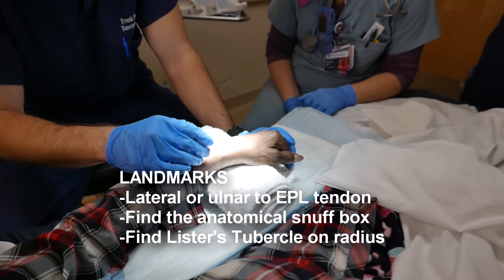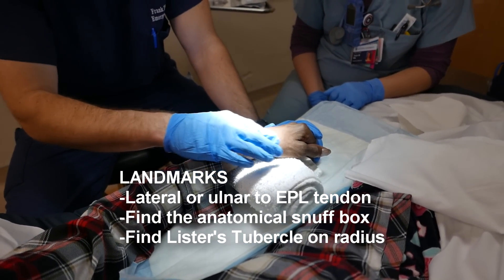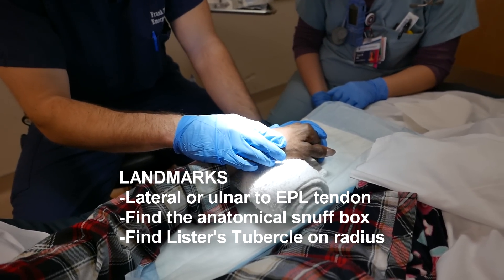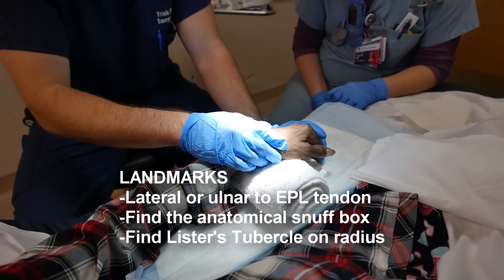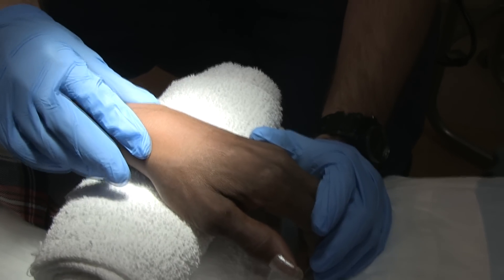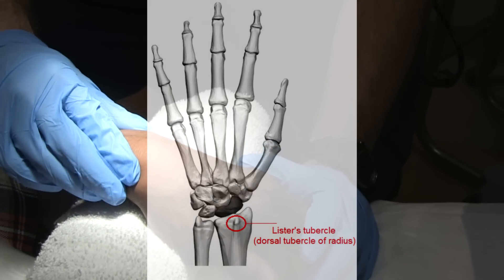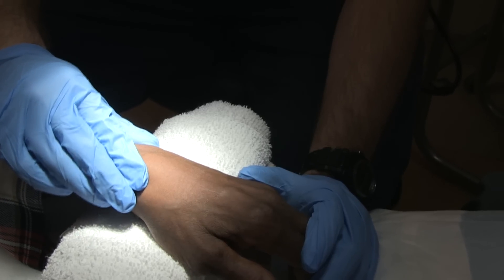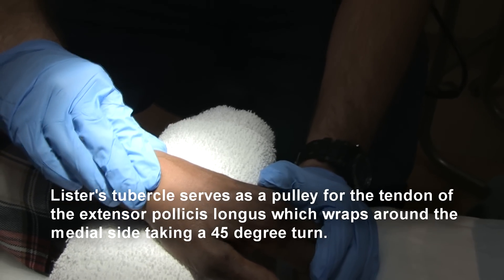A couple other things I can palpate to find that: I like the anatomic snuff box as a landmark in general, because I find it helpful and easy to find even when the tissue is swollen, like in this patient. From there I can track proximally and find Lister's tubercle, which is just on the radius. So I'm finding Lister's tubercle on the lateral part of the radius, palpating dorsally.